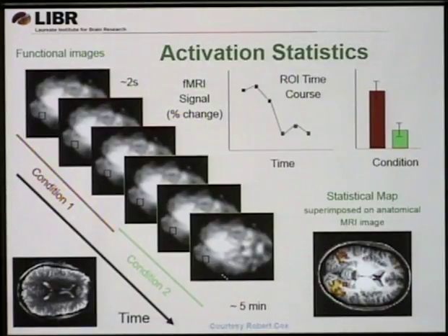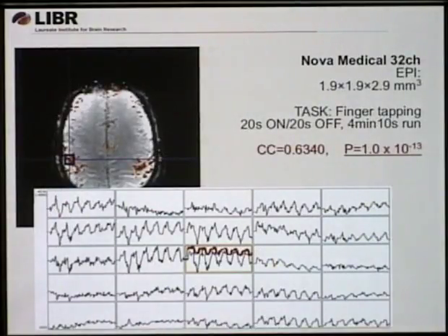And then we can do some statistical approaches and some mathematical approaches to map this difference and assign some number, and to this number we can assign color. Say red means the number characterizing the difference is really high, so we can make it red and put it on top of the structural image. So that's essentially what we do in fMRI analysis. It's actually way more complicated, but that gives you the idea.